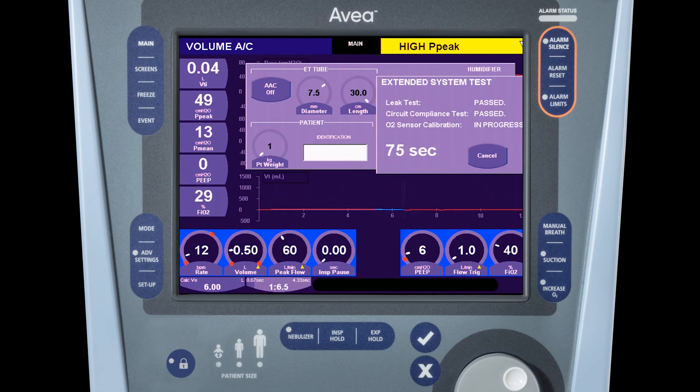The balance of the test is a two-point calibration of the oxygen sensor. For brevity in this video, we have accelerated the timing of the remainder of the test. As we approach the final few seconds of the test, you'll see the O2 sensor calibration complete and display passed. Once this is done, the continue button will appear.